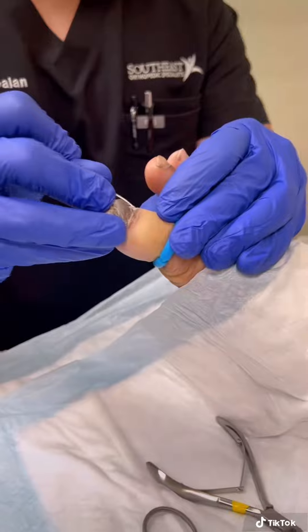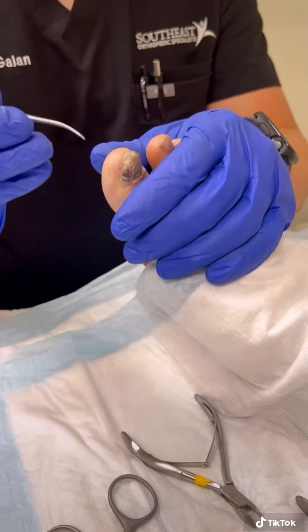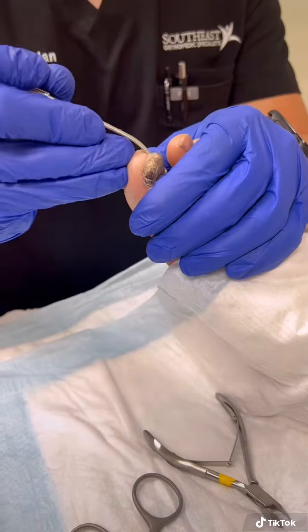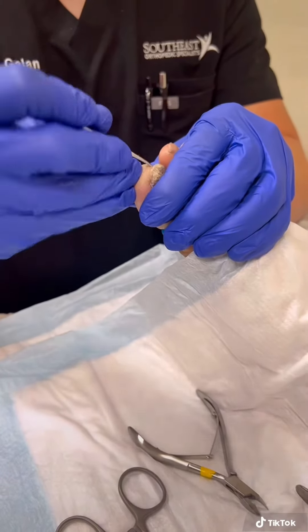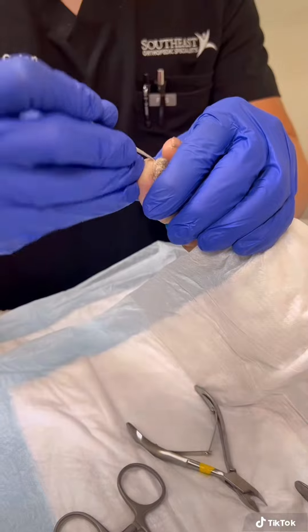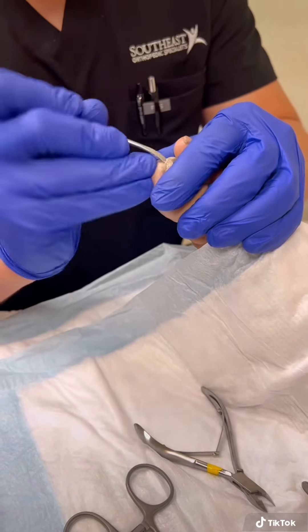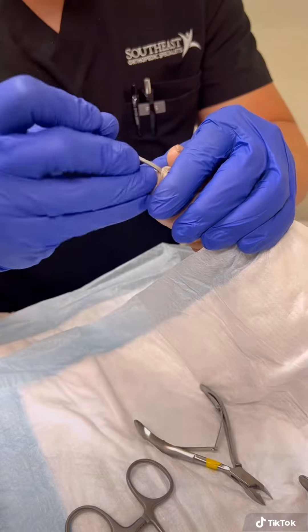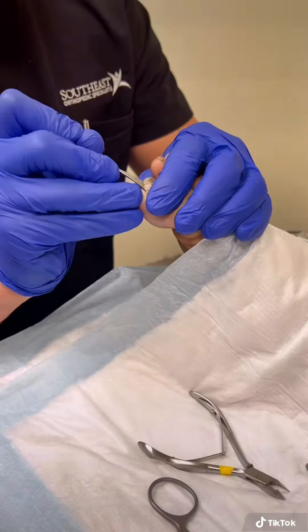Once the top is loose, that's when you go with the other side of the freer and you start to free up the underside of the nail. You just kind of wiggle the instrument back and forth — you let the instrument find the path of least resistance. There it goes. No pain.